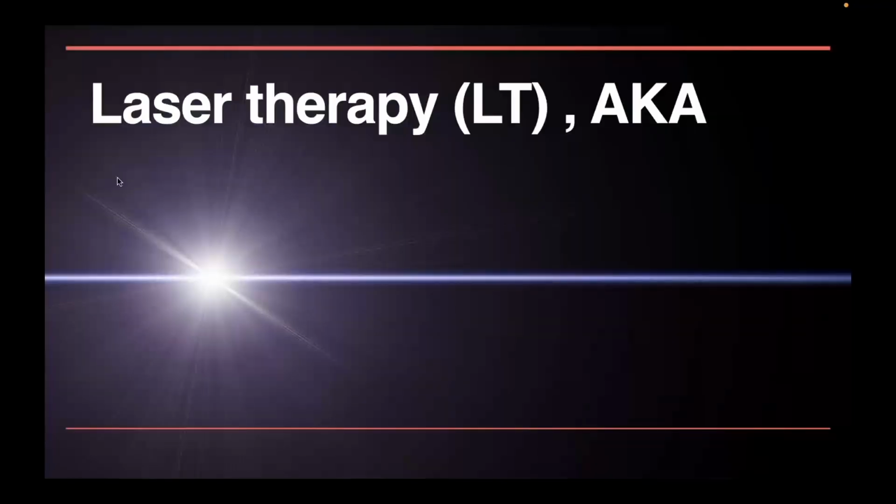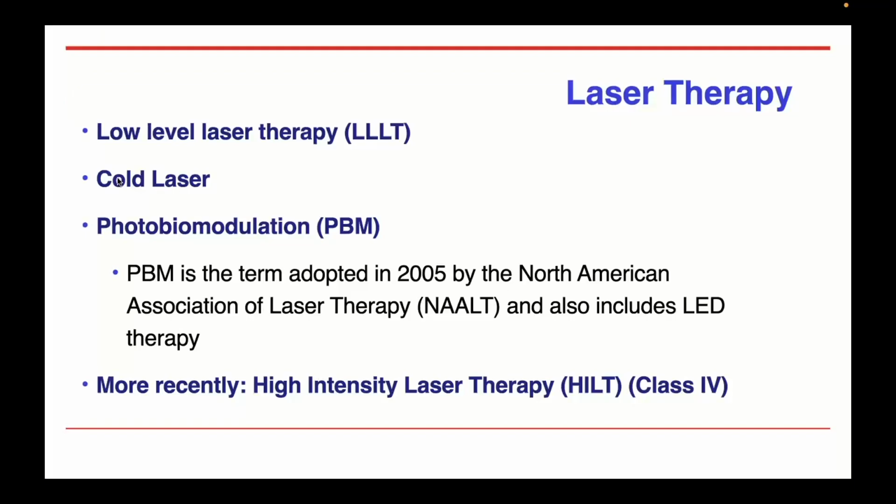You know that laser therapy is a form of photobiomodulation, which is using light to influence biological processes. And you may have heard other similar terms, such as low-level laser therapy. This refers to using light for therapeutic purposes at an intensity that is low compared with surgical or ablative lasers. The term cold laser is not my favorite. It's often used with low-power devices.